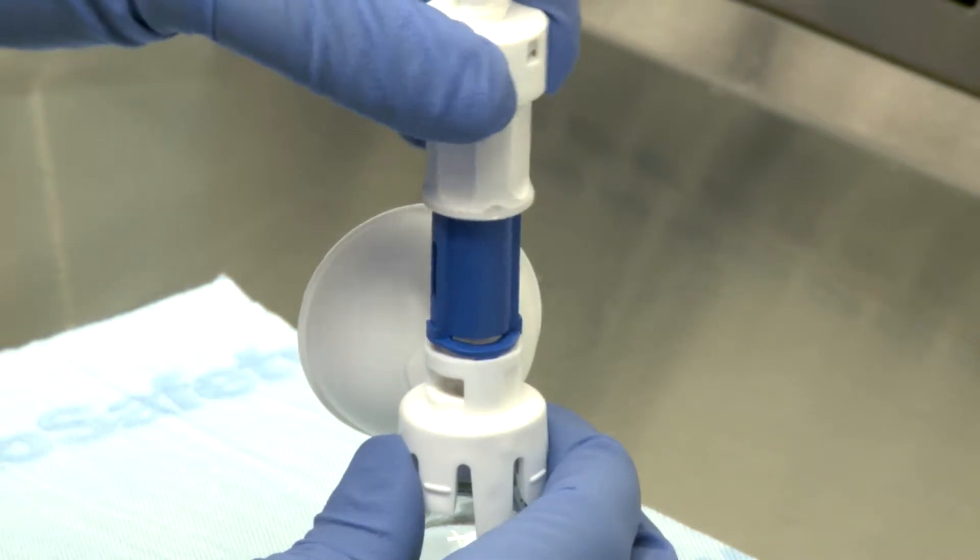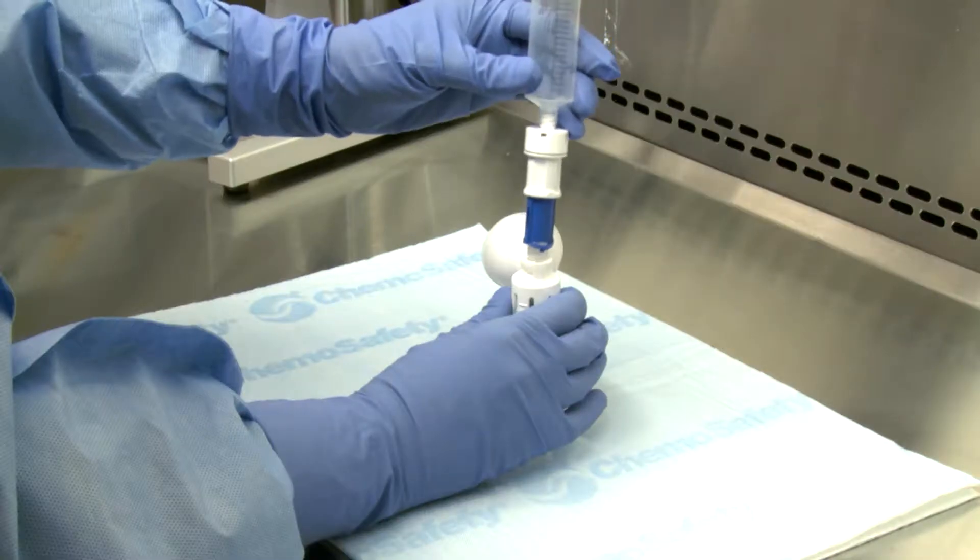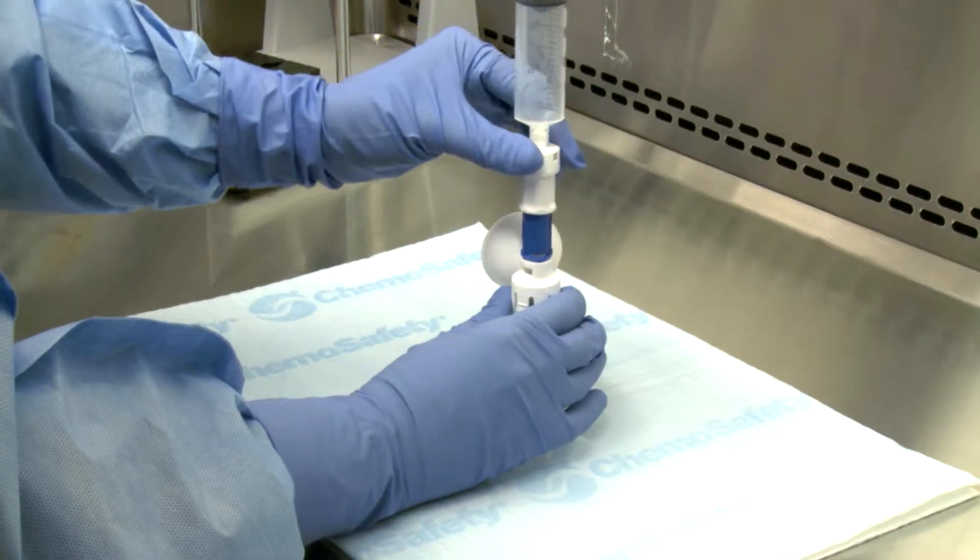Hold the injector at the white finger grips and the white portion of the mating component. Line up the wings of the injector to the notches of the mating component. Be sure not to touch the blue portion of the injector. Next, push the injector into the connection interface.